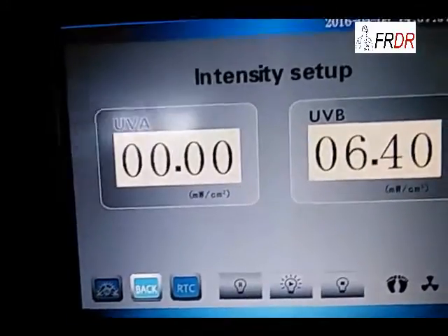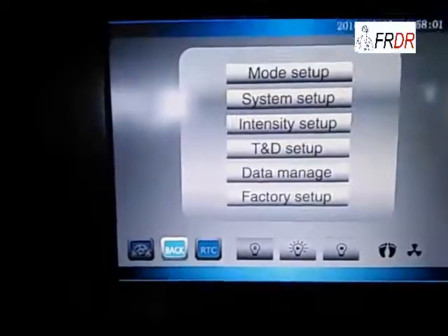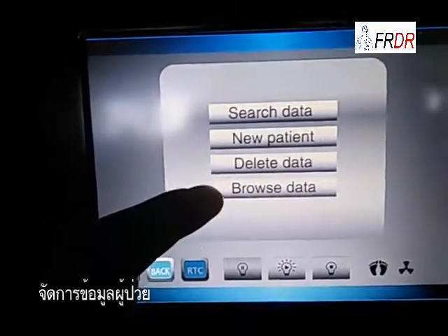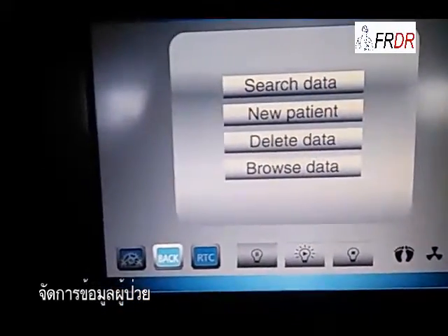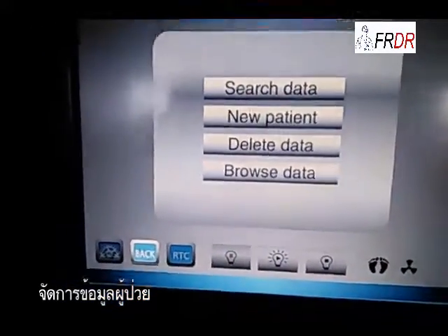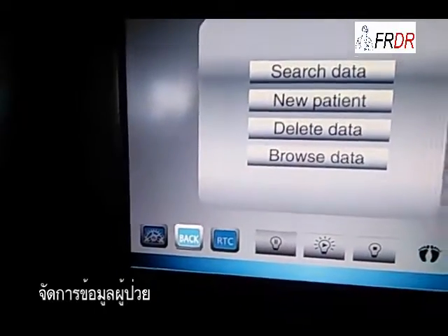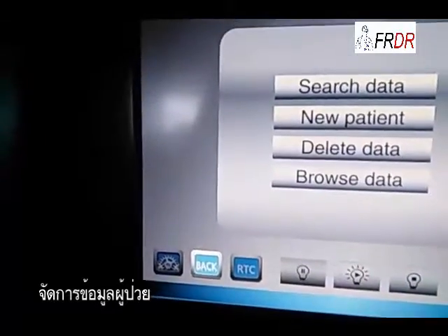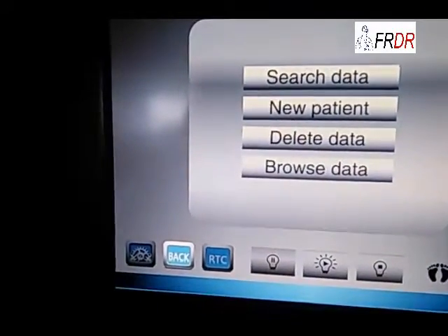This mode is to change the intensity of the lamp. This is to change the date and time. This is data management. Every time a doctor checks the patients, the doctor might give the patient a report. Every time when the patient comes back, the doctor can search the patient's data by report number to see what dosage the doctor gave for this patient before.